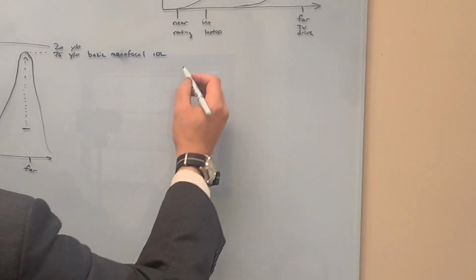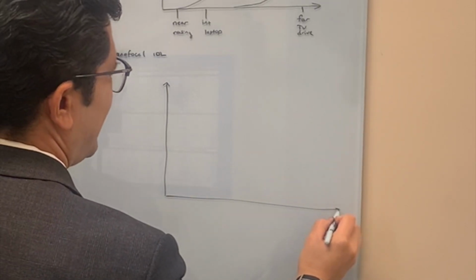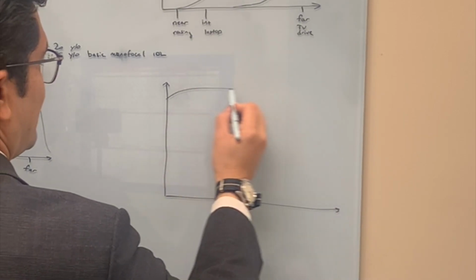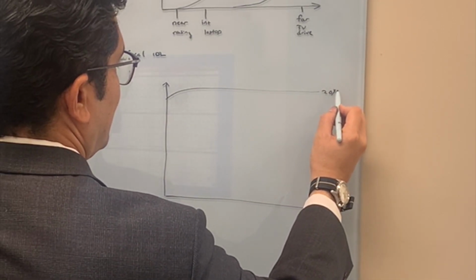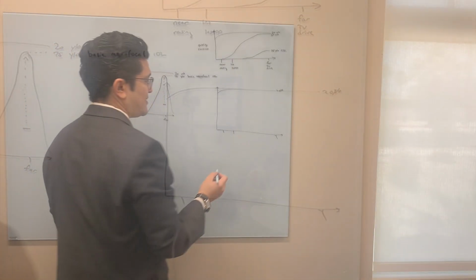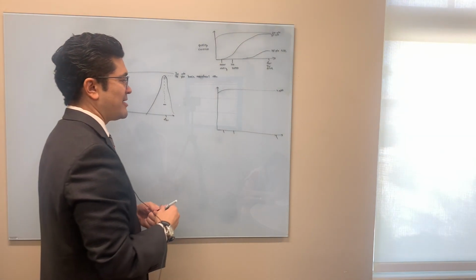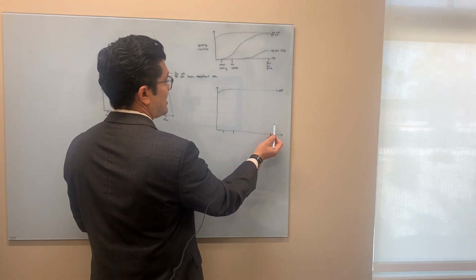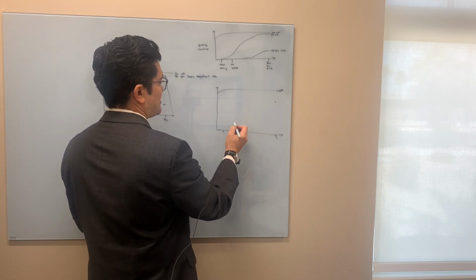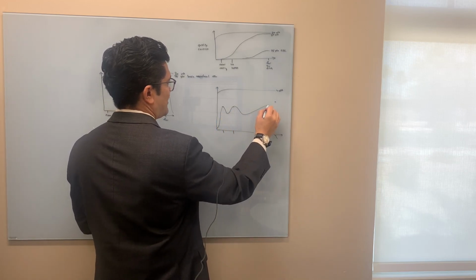And now let's do another graph. Same patient, but let's say we did a multifocal lens. So here's our 20-year-old vision. And now we're going to take our patient with the multifocal, and the classic multifocal, for instance, is the Panoptix lens. We're going to take our patient who's seeing only maybe 30%, we're going to improve it, but it's only going to go to here. It's only going to go to here, and it's only going to go to here. So we're going to have 3 points.